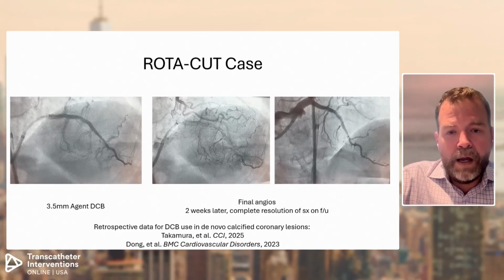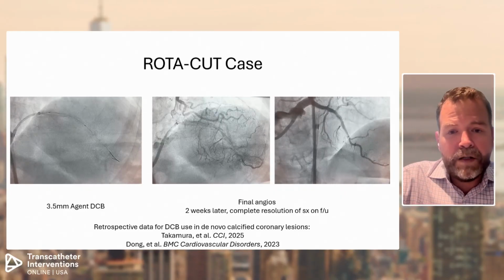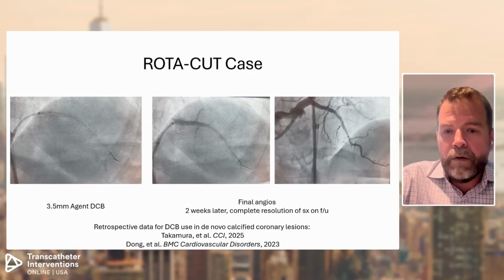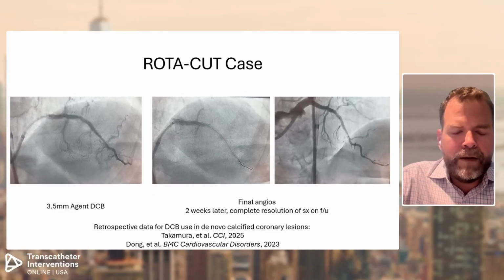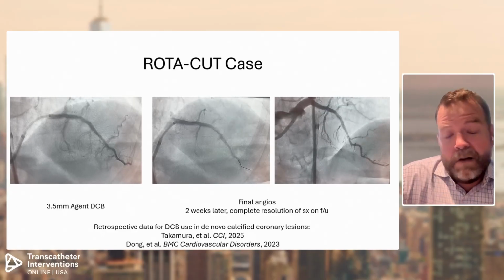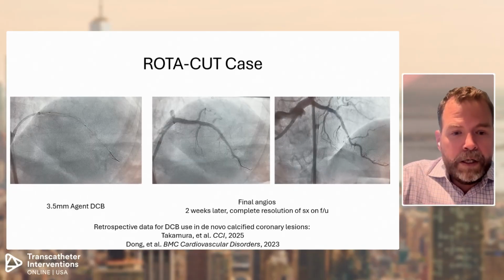You can see the post DCB runs here look really good with preservation of all of those little branches. So it felt really good for her. And she actually ended up coming back. This was a case just a few weeks ago, but she came back a few days ago and had complete resolution of her symptoms. So felt really good about that.